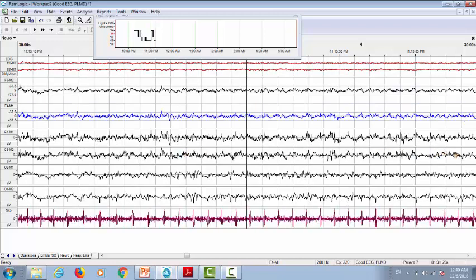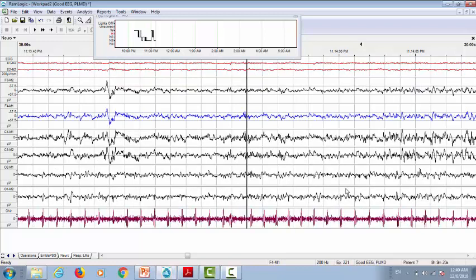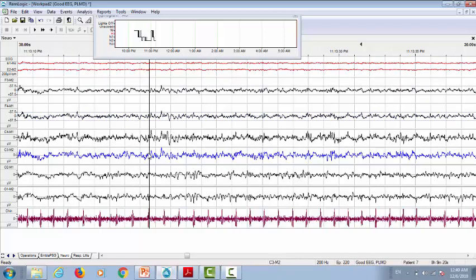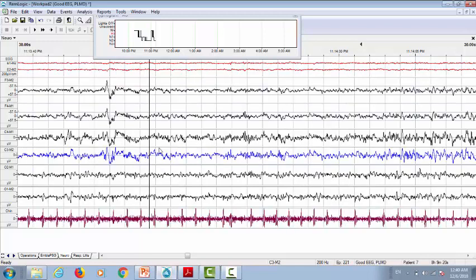We don't have any clue here. We don't have any sleep signature at the end portion to score this as N2. So we keep it in mind and we go forward. There is an indication for N2 here, which is the K-complex. So we go back and score this epoch as N2. Here, we need another K-complex or spindle at the end portion of this epoch, or in the next epoch, in order to score this as definite N2.